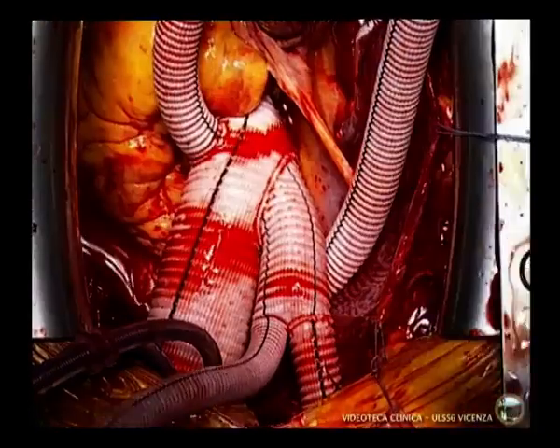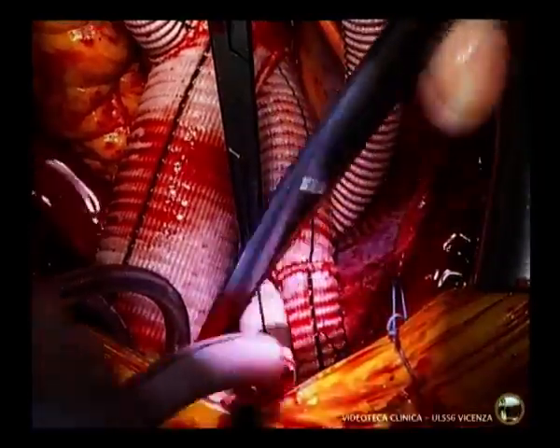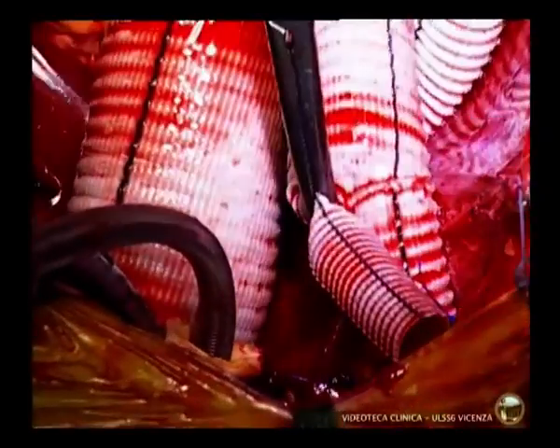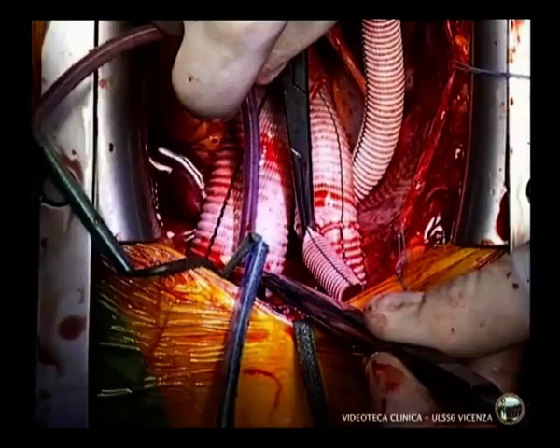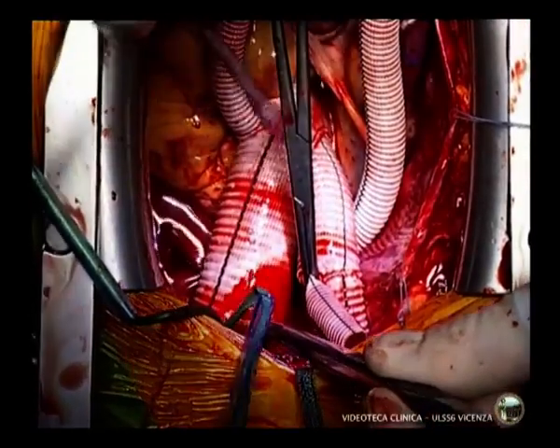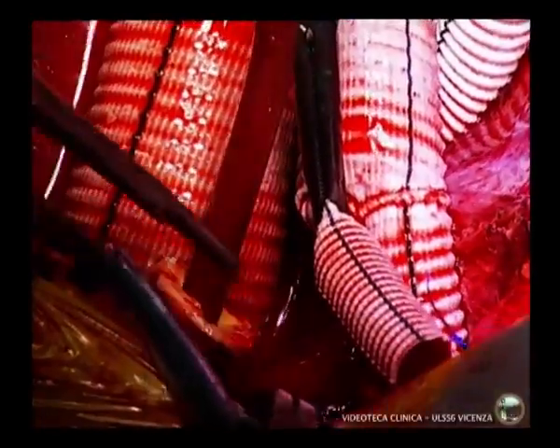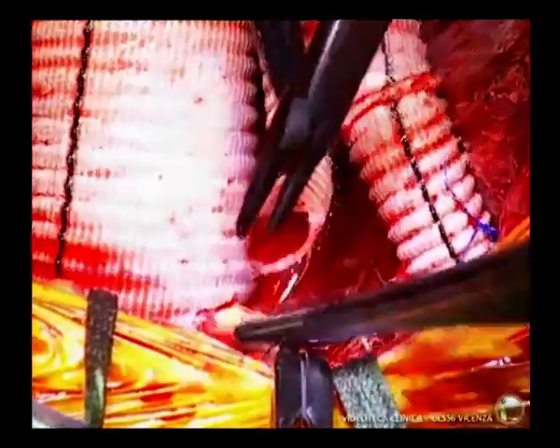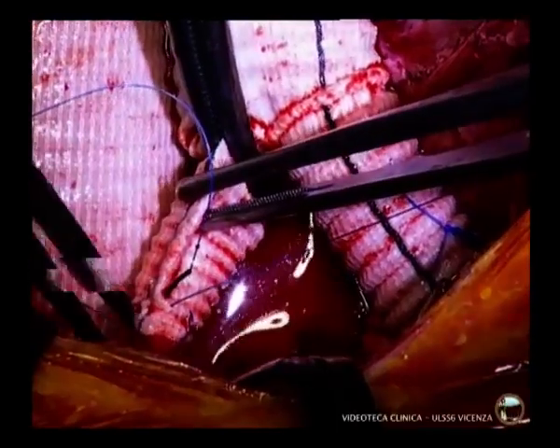Stop the cerebral perfusion. Control the backflow from the left common carotid artery. Preparation and implementation of the anastomosis using 5-0 polypropylene continuous suture.